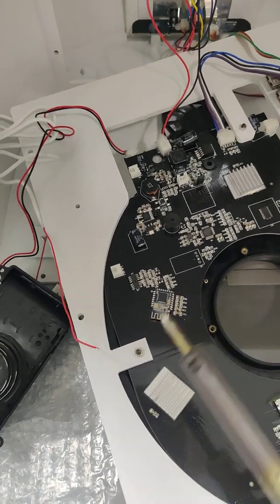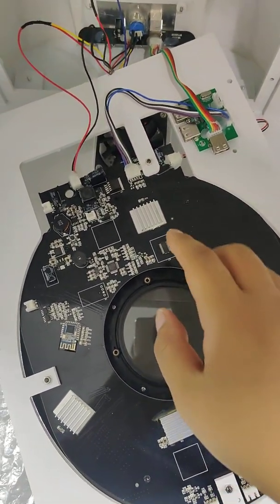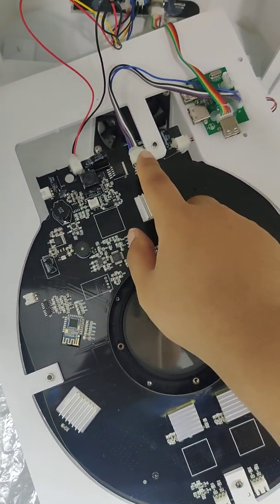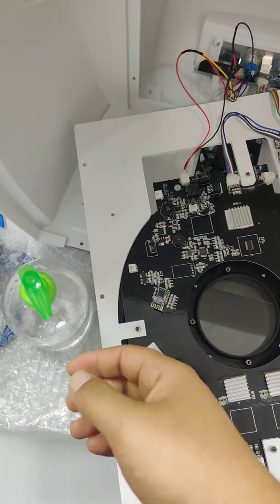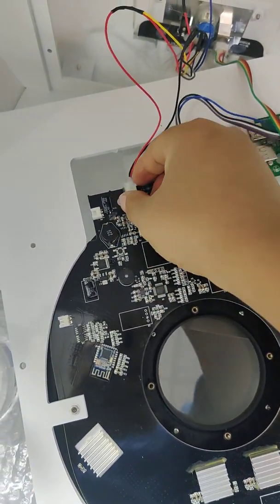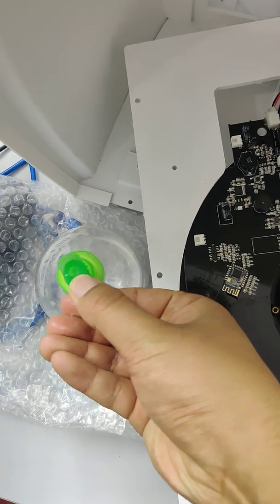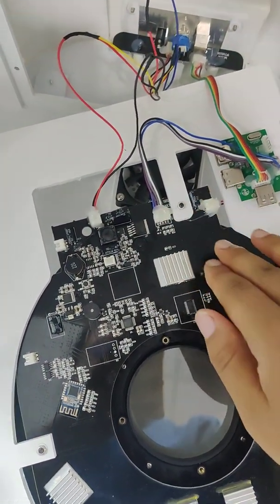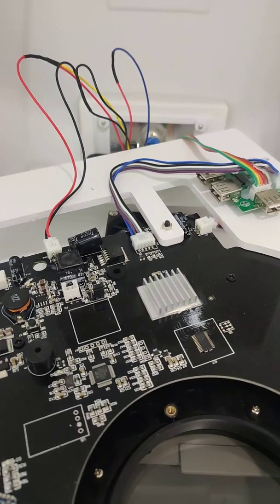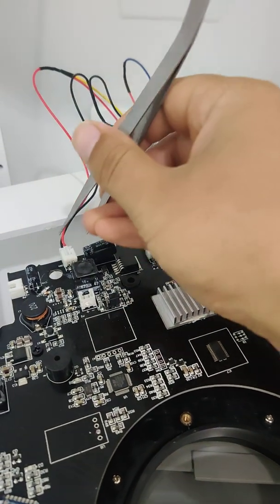Okay, you can see I use this to heat up and then I take it off. Okay, now we take off the camera. We need to take off this cable, and this cable. Now still we use the alcohol, okay, to put some alcohol here so we can take off the gel, and also here we also need to put some alcohol here. Okay, then we take off this and this 3 cables from this panel. Okay, we use this tweezer to take off this.